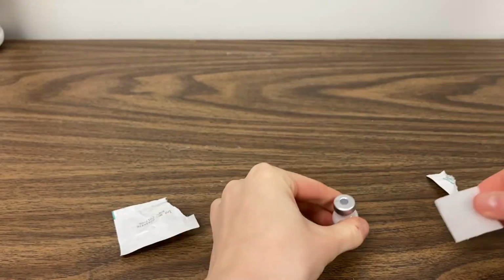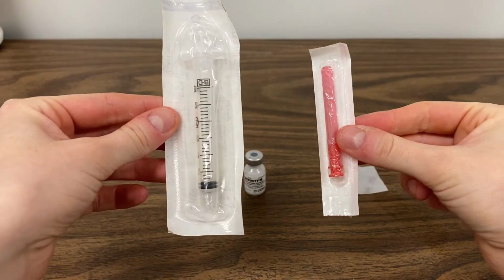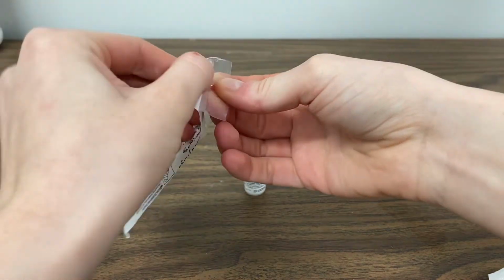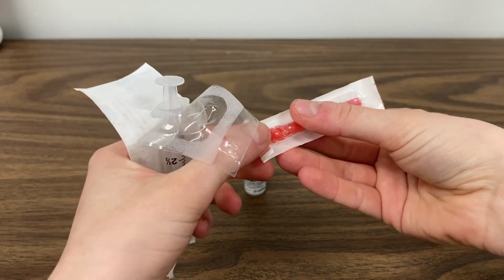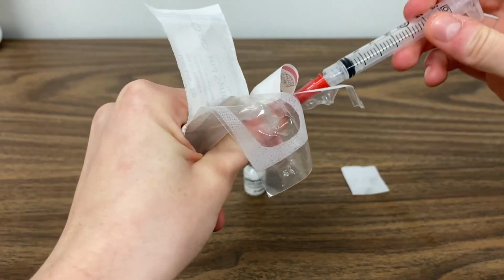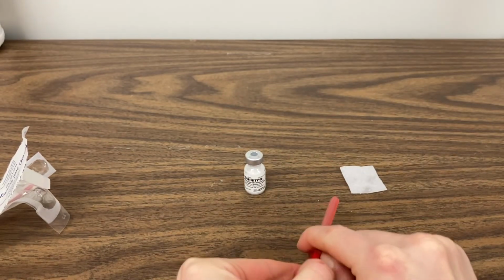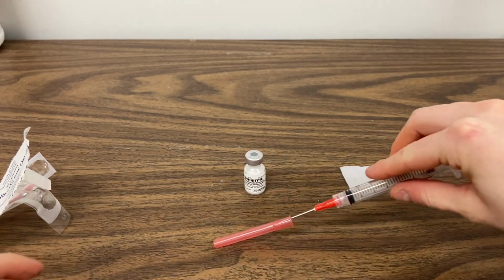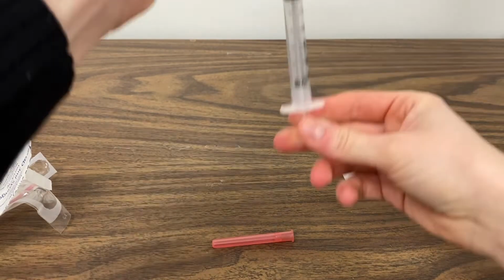The solution of Definity needed for carotid scanning is 0.2 milliliters of Definity in 2.8 milliliters of saline in a 3 ml syringe to give you a 3 milliliter contrast solution. You will need 2 of these syringes, approximately 1 administered per side you scan. This is administered through an IV, just as you would use contrast for the echo portion.